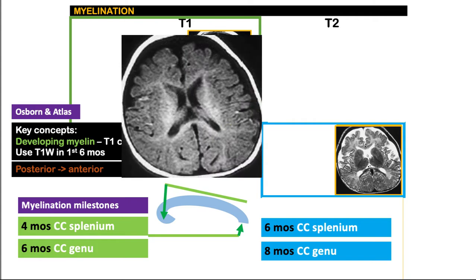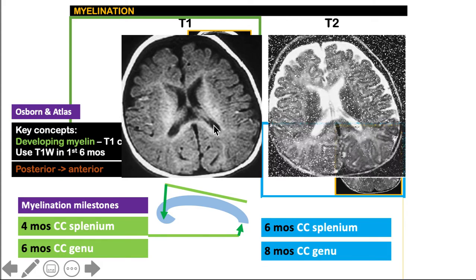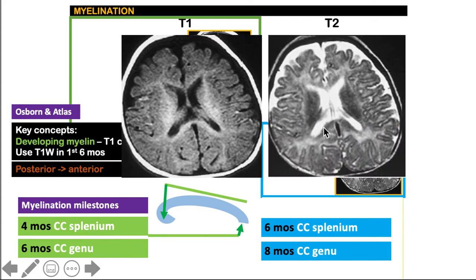Let's take an example. This is a T1-weighted image — could this be a newborn? We see hyper-intensity on the corpus callosum, so this must be an older child, at least four months old. When we check the T2, there is already hypo-intense signal on the same area, so this must be a child who is six months of age.